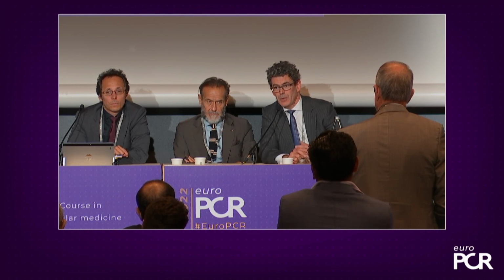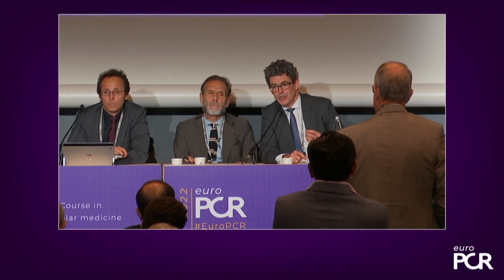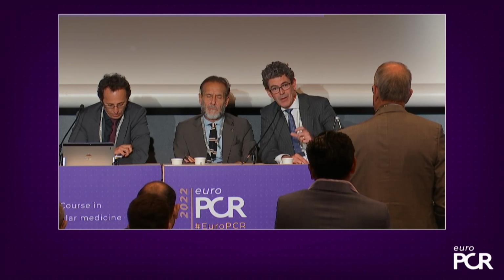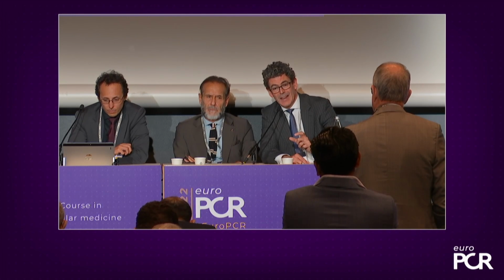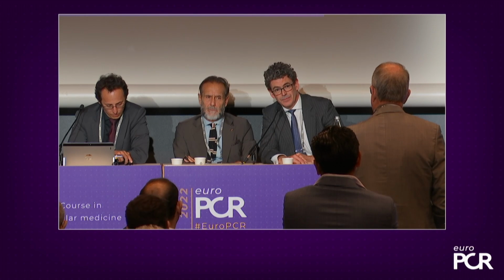The argument now shows that you achieve maximum modification with the more shocks that you deliver. It would be sharing out the shocks according to the areas of the densest calcification, but don't neglect the areas where there's deep wall calcification.